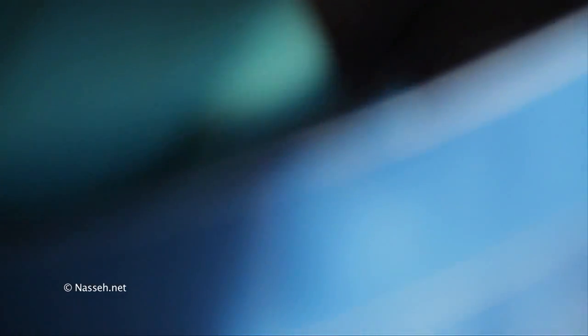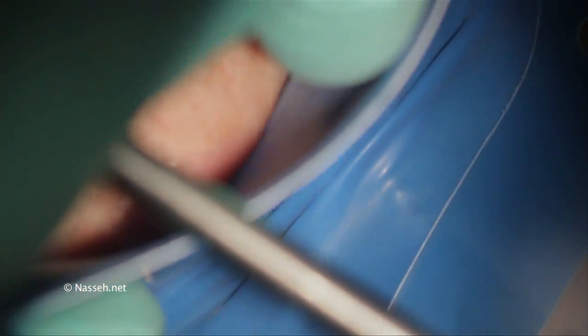Here I'm using the Huphredes Clamp 13A in order to isolate tooth number three and then pull the rubber dam over tooth number four, which is going to be treated.